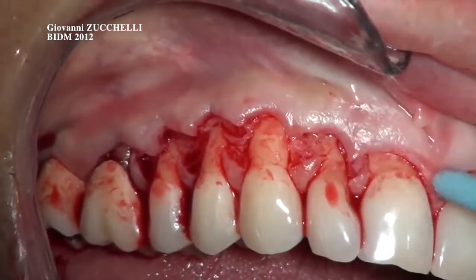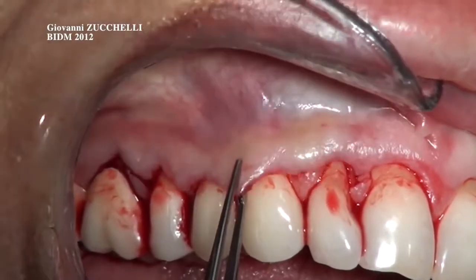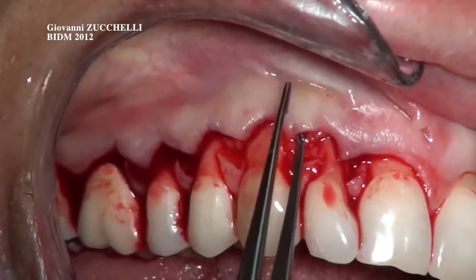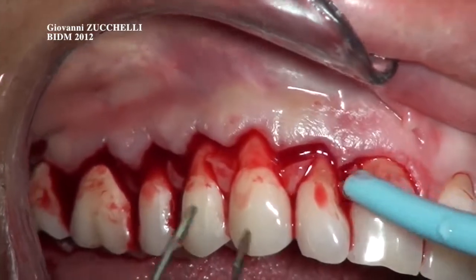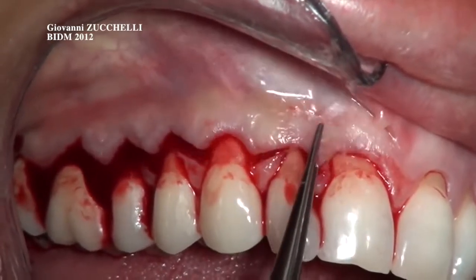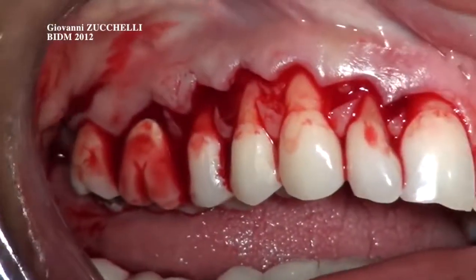In fact, this is enough to allow the coronal advancement of the flap only in the main portion of it. You can see now I am able to cover the canine, I am able to cover the premolar, and I am partly able to cover the lateral. What we have to improve is the movement of the flap in the distal and in the mesial aspect in order to cover also the central and the lateral. So we go to the molar area.